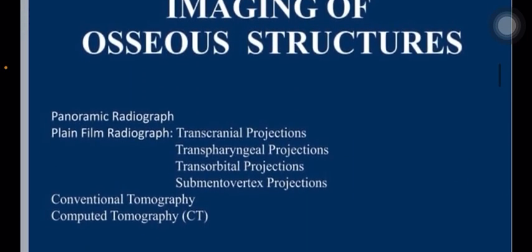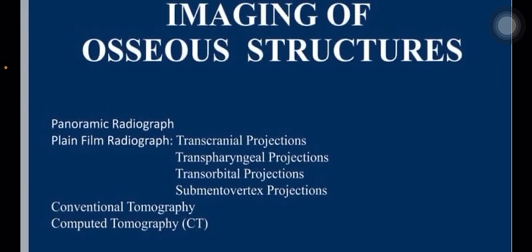Again, imaging of osseous structures. In plain film radiography, we have transcranial projections, transpharyngeal projection, transorbital projection and submental vertex projection.